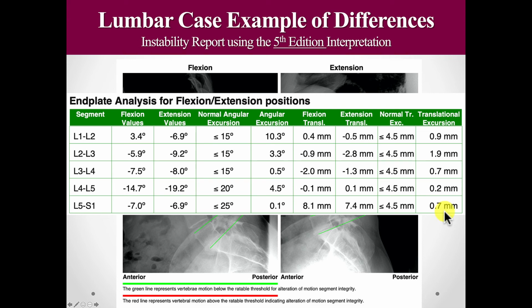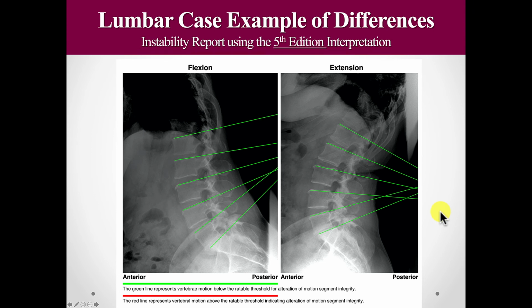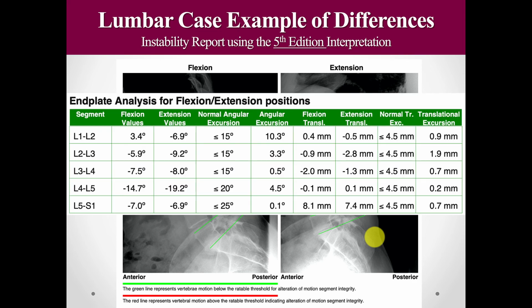Are you telling me that that's a nice spine, if this is a person that does normal activities? Do you think it makes a difference? Of course it does, right? This segment, this area of the spine is set up for future injury at a much lower threshold because of this. For the 5th edition not to classify this as a problem is very erroneous in my personal opinion. Always put that caveat there. But if you're going to use the AMA guides, hey, know what you're dealing with, right? 5th edition, there you go.